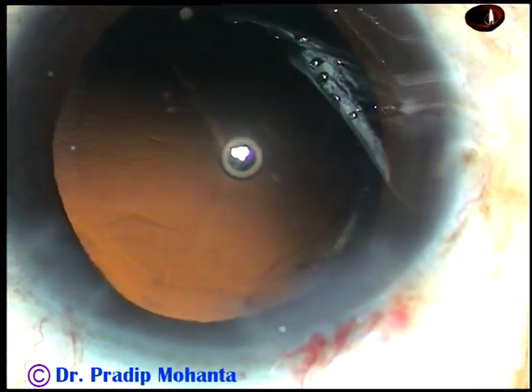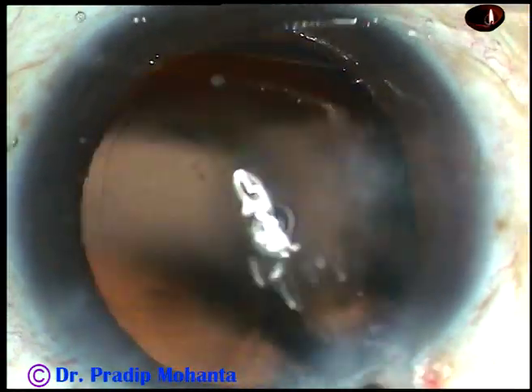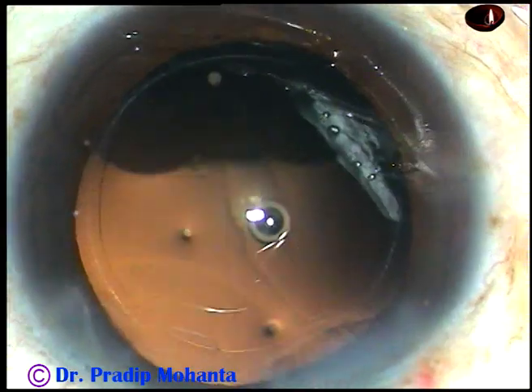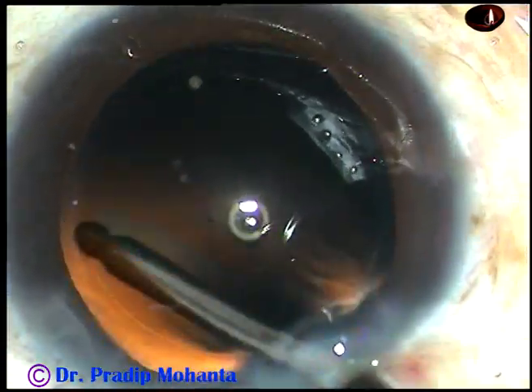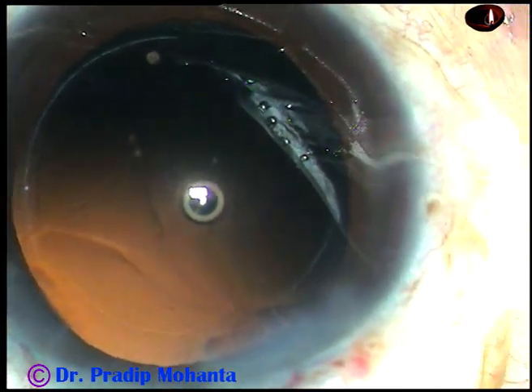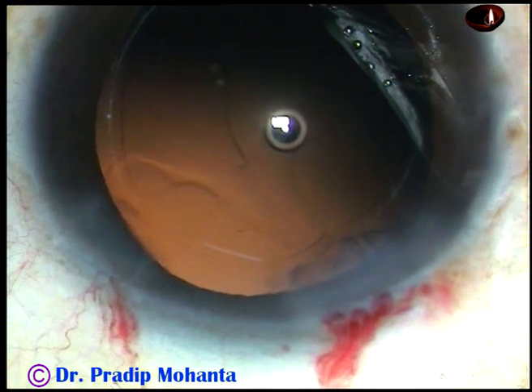Now I can see there are a lot of cells sticking to the posterior capsule, and here comes hydro polish — polishing the posterior capsule with the help of irrigating fluid from the irrigating probe of bi-manual irrigation. The posterior capsule is very nicely getting cleaned; it is almost shining. The anterior chamber remains always formed, the posterior capsule is not even touched, the fluid wave is swept over it, and the cells get dislodged.